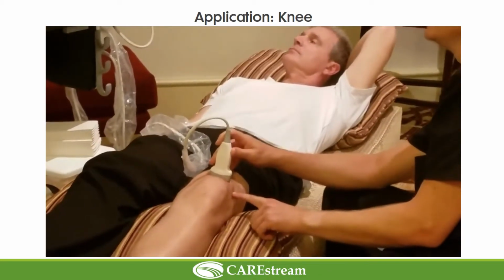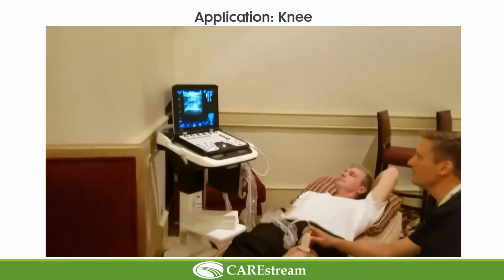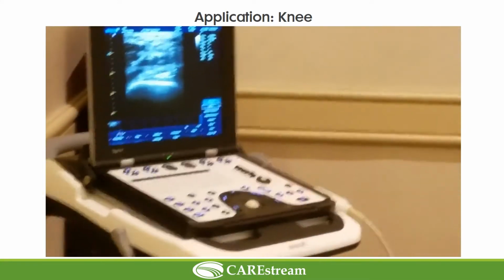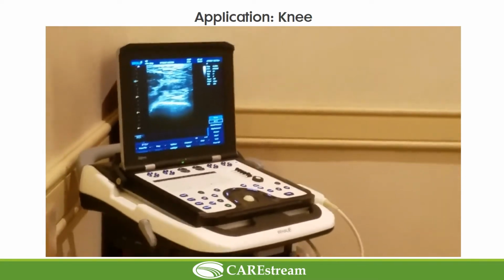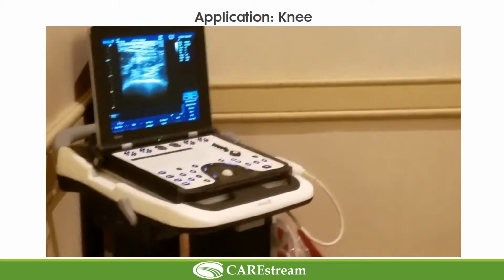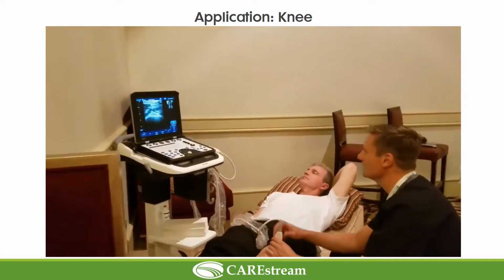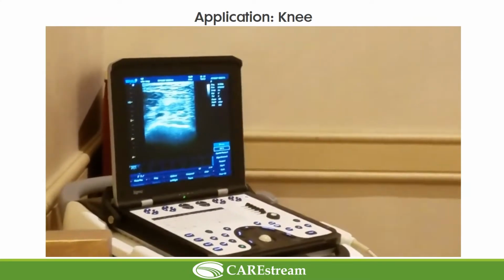Here, and I'm going to inject exactly perpendicular to the probe, and when I do this, you can actually see tissue moving. So I'm at the right depth. Where the tissue is, one tissue looks to be sliding over the other tissue. Hopefully you can see that with motion. That is the suprapatellar recess. You would like to park your needle on top of that moving space.